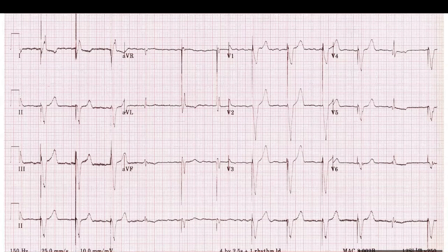So that's why. Now you tell me, what about the atrium? The atrium? I could say that before the first paced beat, the 6 from the right, there are 3 P waves.